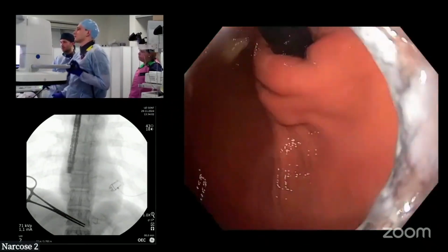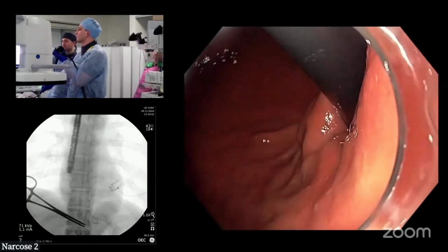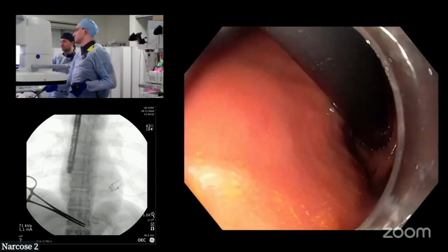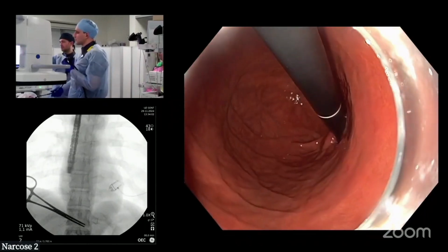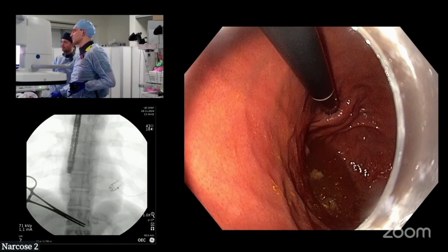So here you can see, just push in a bit. Really just push. That's cool. Push, turn, push. Just show an overview. Left a bit. Other way. Yeah, good, like that. So you see the wrap clearly here, and you see quite a developed flap valve at the bottom.